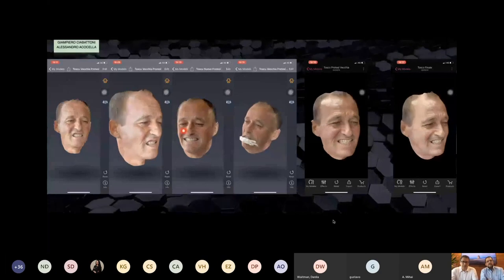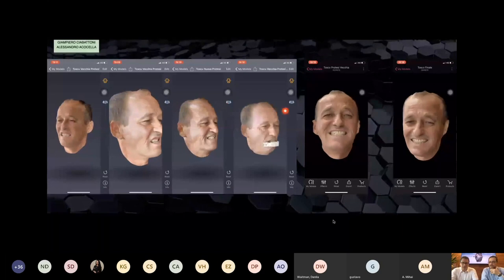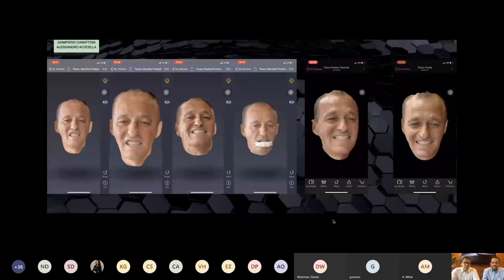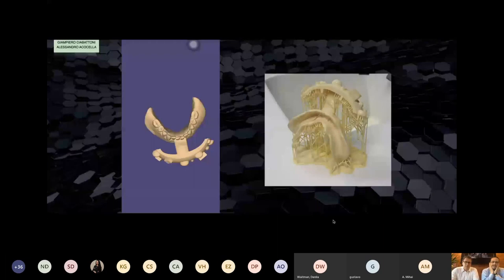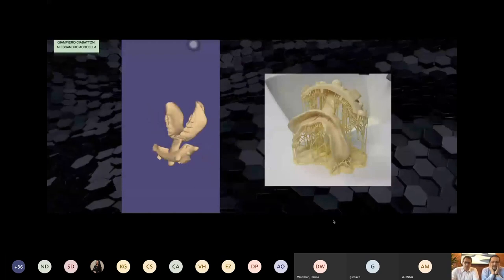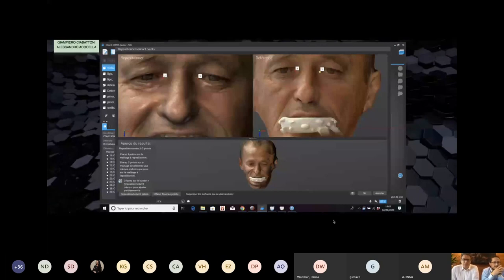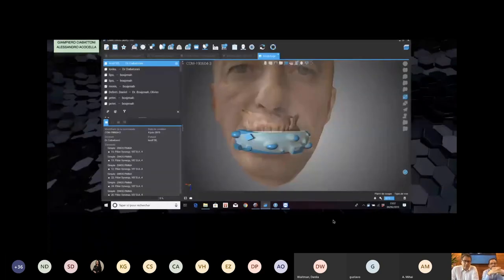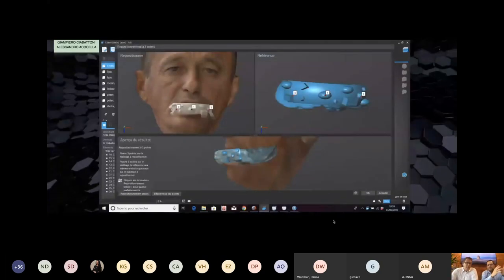You see on your left this not corrected prosthesis, the new situation, but we also use this new wax-up with the extra oral stent, as you see here, because we learned that it's an STL file, so we want to have something to mesh on the open software, like co-diagnostic software. You can enter the STL file of the face of the patient, and we can orient it in the right position according to the prosthesis worn by the patient during the CT scan. So we have all the information matching together.